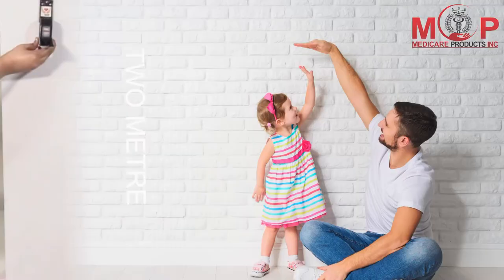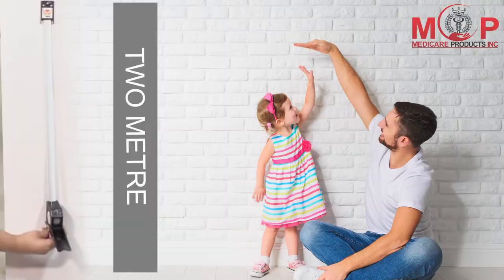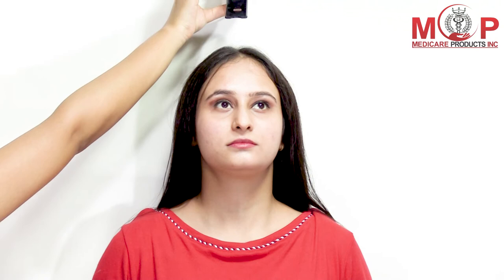First, fix the instrument 200 centimeters above the ground with the help of the screw provided and double-sided tape. Then ask the subject to stand against the wall with legs joined together, and roll down the stature meter on the head.